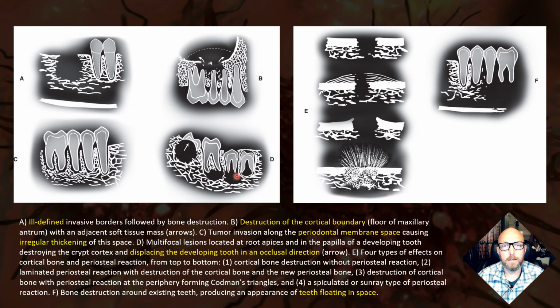I would think of leukemia as a primary one if it's a young patient and they have developing teeth, but also Langerhans and lymphoma can do that. They can develop in and around the apices of developing teeth.